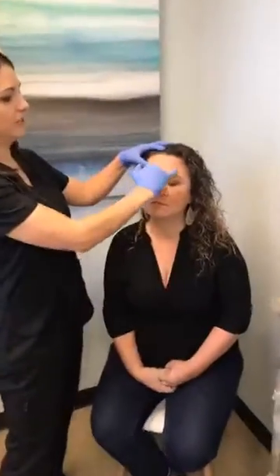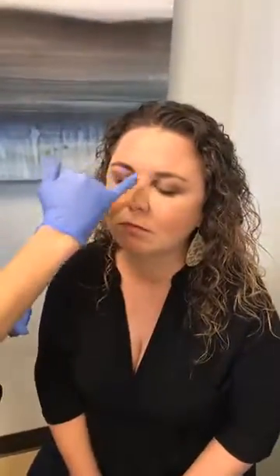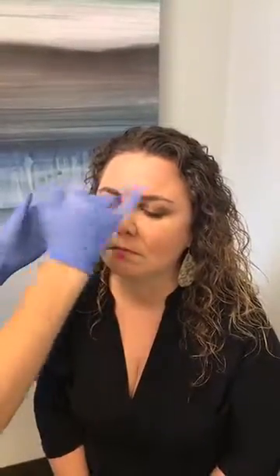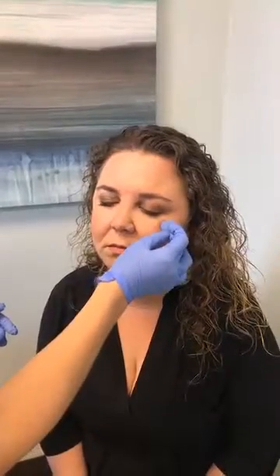And so we've decided where the injection sites are. How do you decide how many units people use? Well, for the glabellar complex through here, Allergan recommends 20 units. Allergan is the company who manufactures the Botox. For this area, anywhere from 12 to 20, 25 units, depending on how strong the muscles are. Around the eyes, I would do 6 or 7 units on each side. So that gives you a good idea.